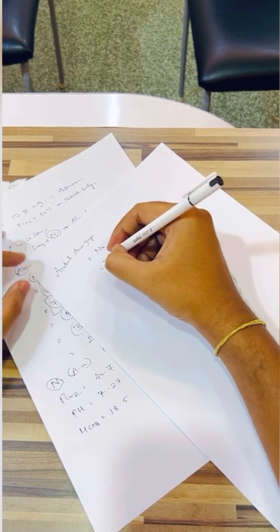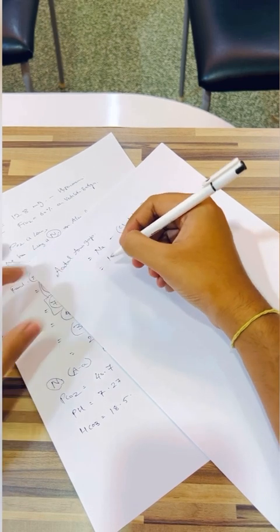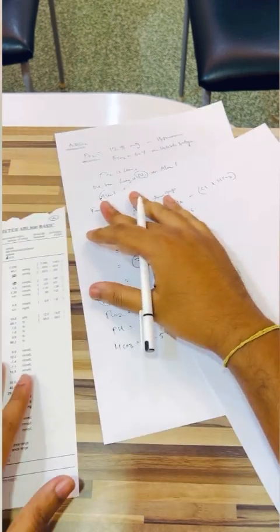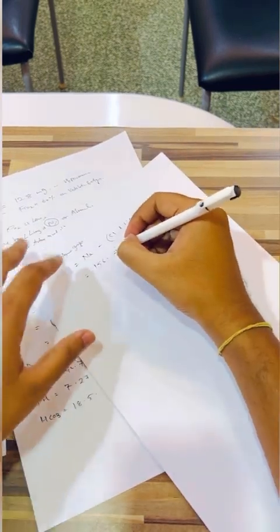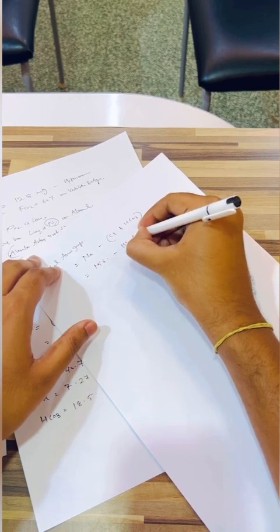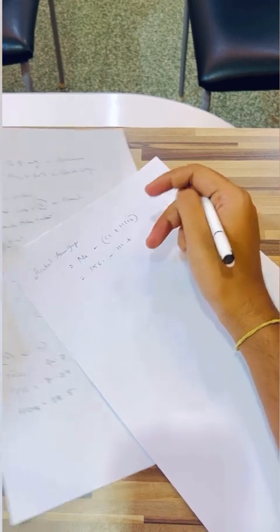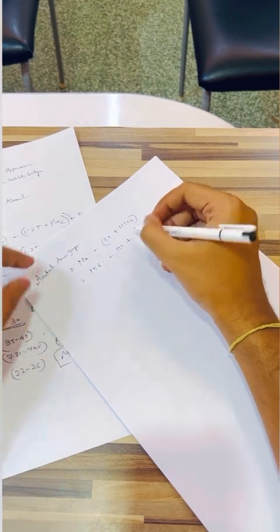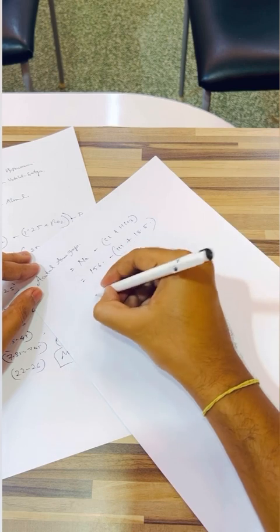In this case the sodium of the patient is 156, minus the chloride, which is 111 for this patient, plus bicarb, which we have seen before, 18.5.